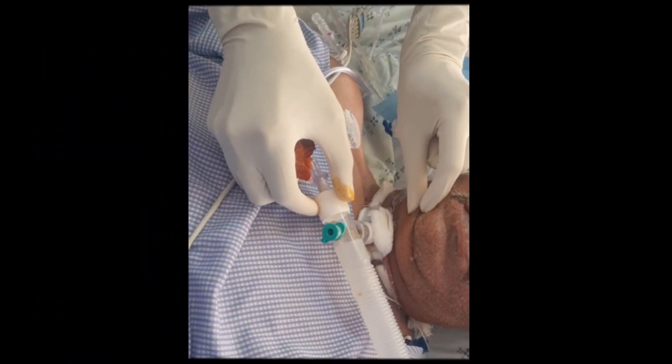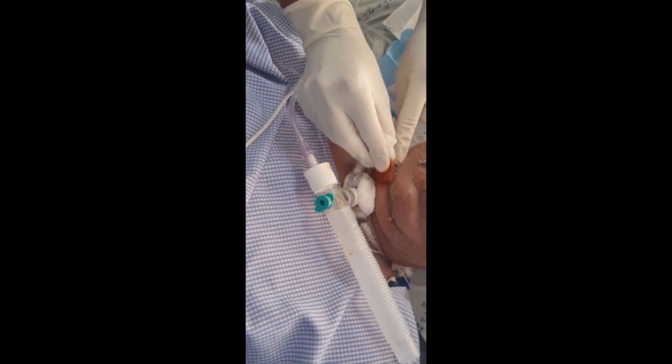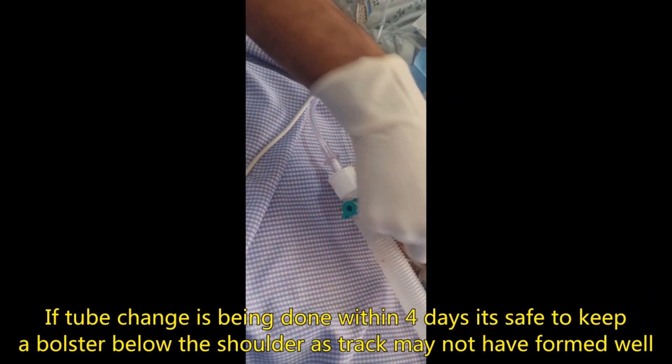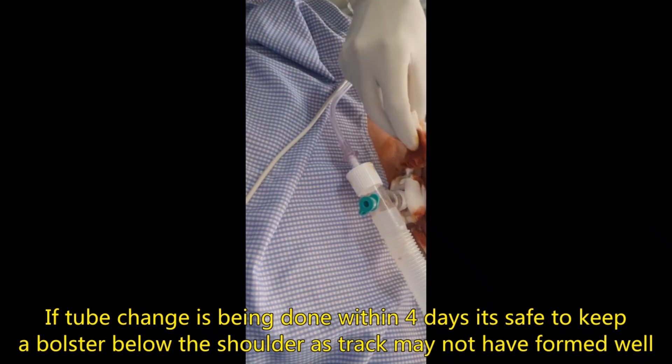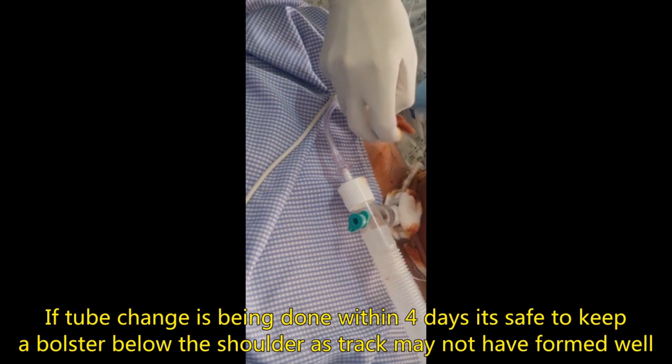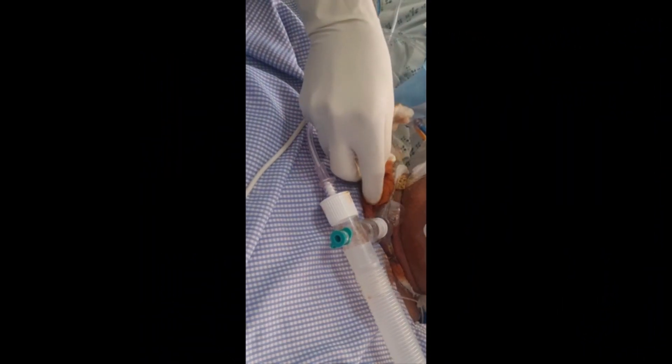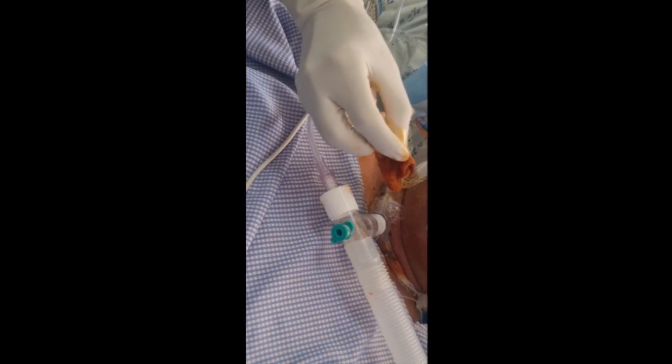How to change the tracheostomy tube: clean the local area with betadine or povidone iodine solution and remove the dressing. There can be a coughing reflex from the patient, so at this moment we will do good suctioning.